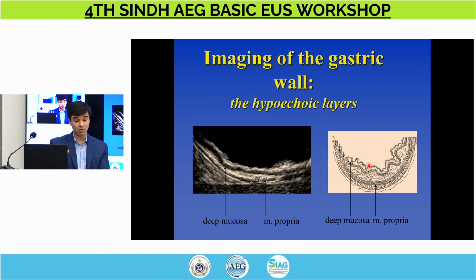Now, this is a normal. We've gone through all of the abnormal, but learning to identify this is essential to diagnostic EUS. So I'm going to point out the dark structures, and let's talk about what they are. The first one that is easiest to identify is the thick black dark structure located outside, the furthest structure that you can track down. If I were to look at a histological correlate, this is what the structure would be. So I'm putting my cursor here. Any takers? What is that?